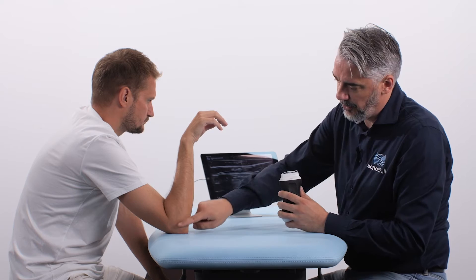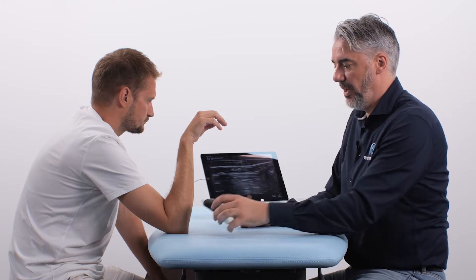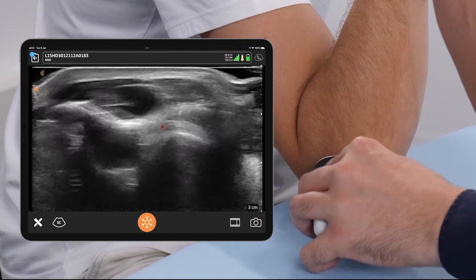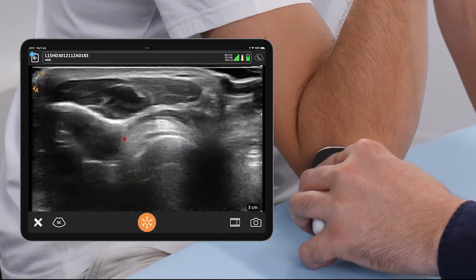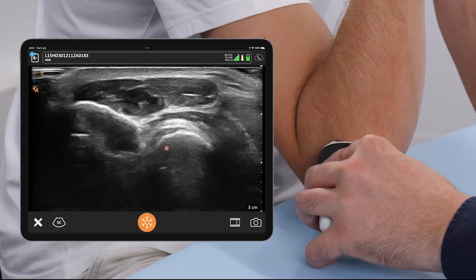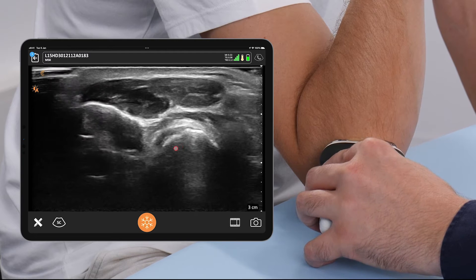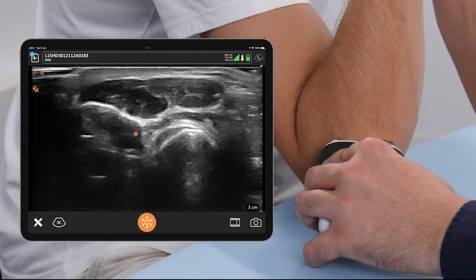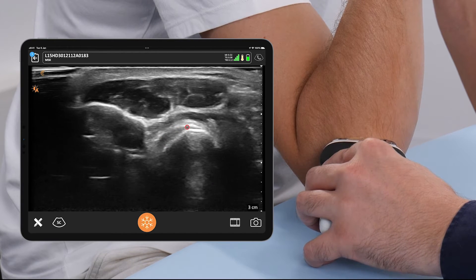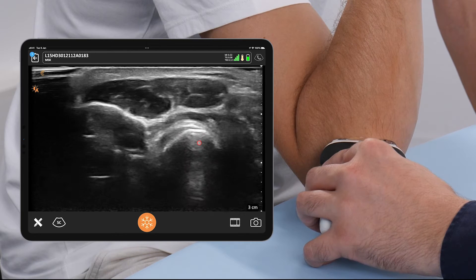With the ventral approach you could not see the insertion, but this dorsal approach is really focused on the insertion. The transducer is placed on the dorsal aspect of the elbow in transverse view. What we can see now is the ulna right here, and this is the radius — so this is the radioulnar joint — and in between we can see the distal biceps tendon inserting into the radial tuberosity.